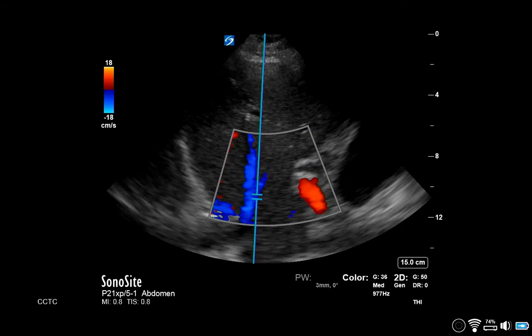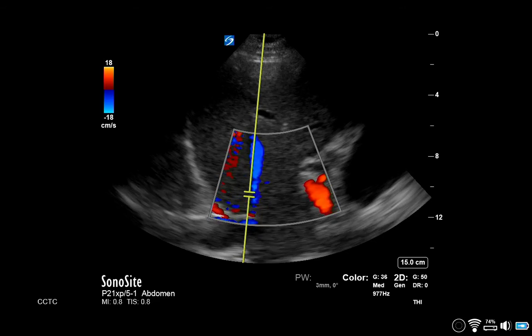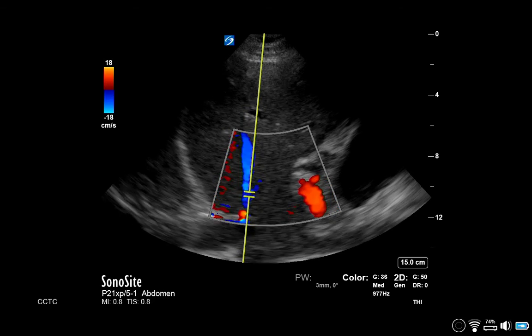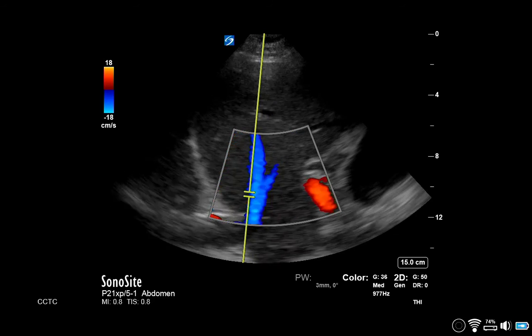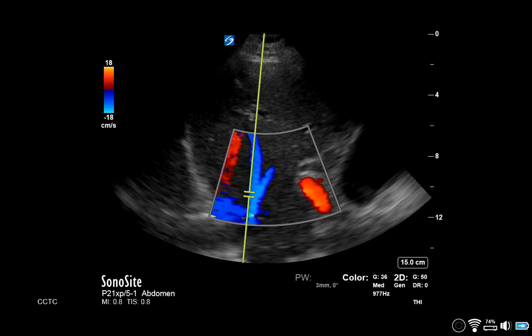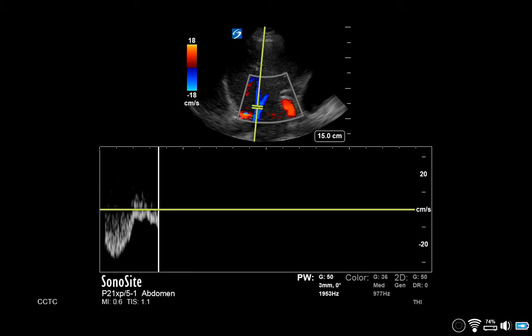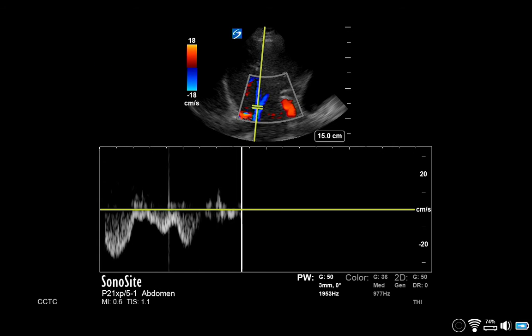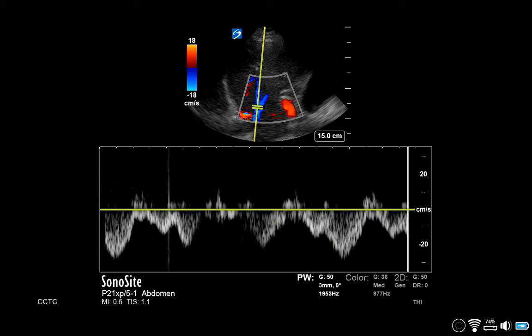Enable pulse wave and place the gate in the proximal hepatic vein at end expiration, a couple centimeters distal to the IVC. Enable pulse wave and observe the waveform over several cardiac cycles.